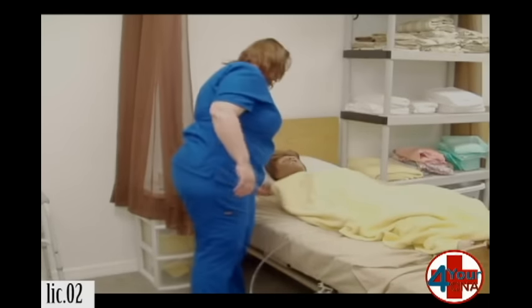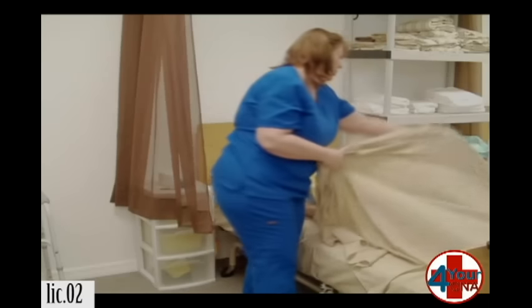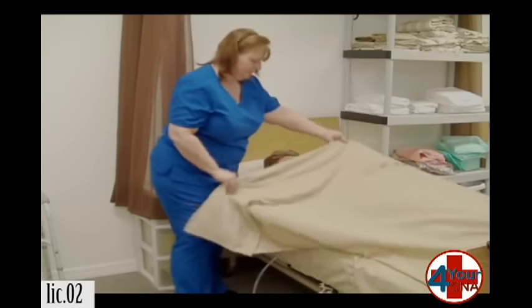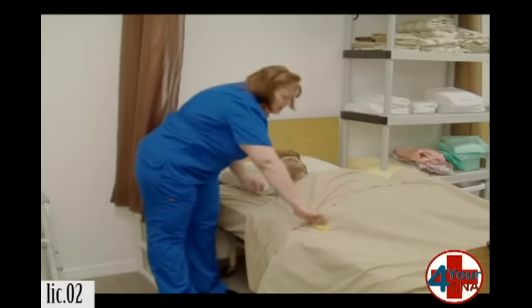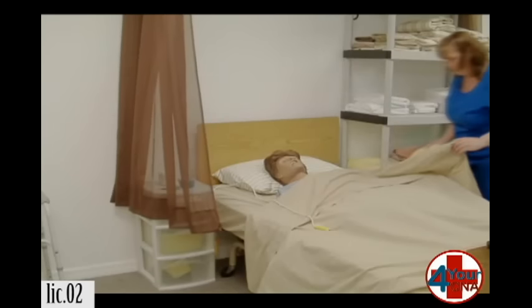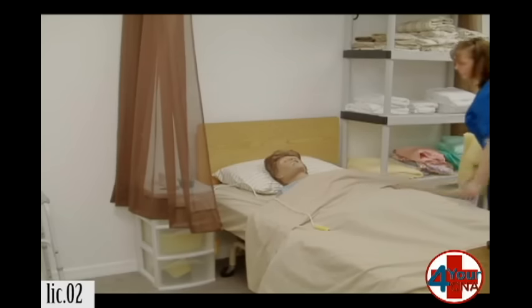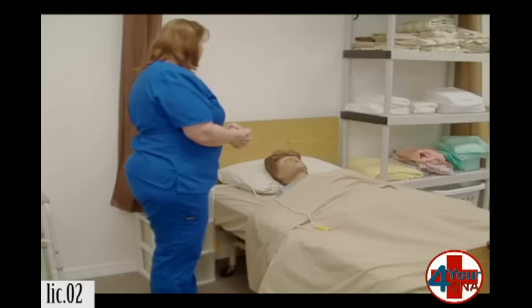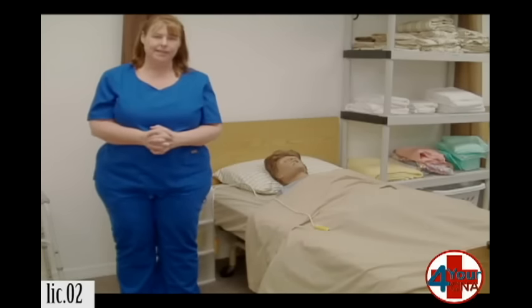I'm going to remove that blanket from you — touch the underside, fold it over — and pull your sheet up. Again, make sure that catheter's not kinked or touching the floor. Here's your call light if you should need anything. I'm going to put these in dirty linen. I'm going to open up your curtain. Is there anything else I can get for you while I'm here? No? Okay, I'm going to wash my hands. I'll review all the steps of my skill, make any corrections as necessary. My skill is complete.